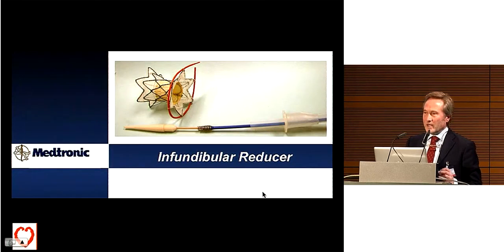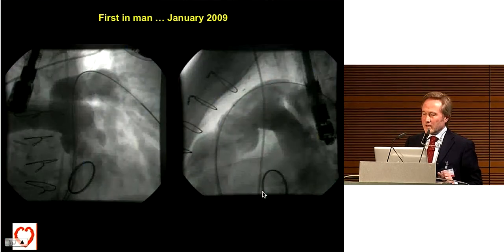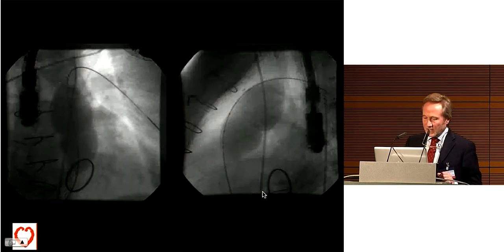Well, a preliminary experience with the Medtronic infundibular reducer, or whatever you call it, a new self-expandable device with an hourglass shape, was actually implanted in January 2009 as a first-in-man experience in London by Philipp Bonhoeffer, and I had the chance to take part with him in this procedure.